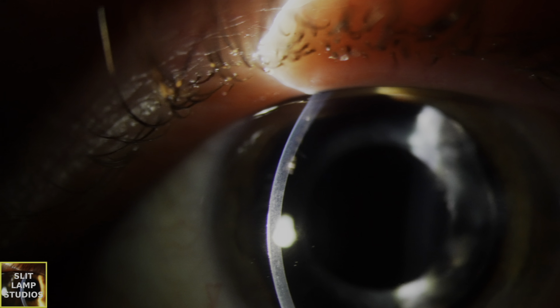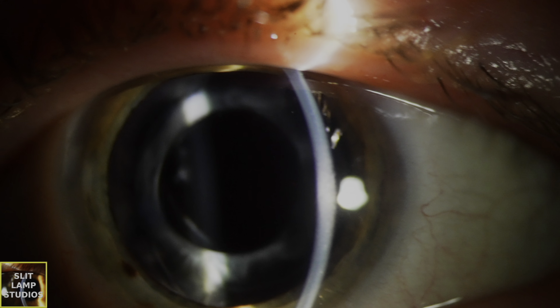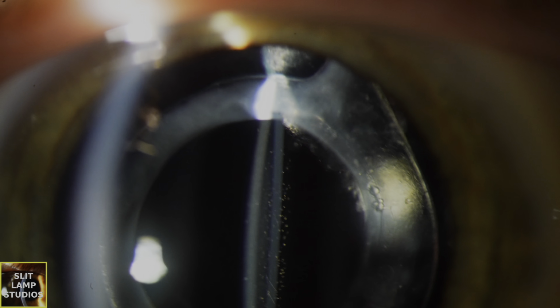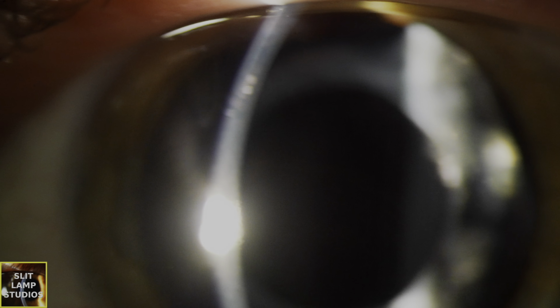So in this other eye, the patient's pseudophakic. They've had cataract surgery. You can see they've also had a YAG capsulotomy. And let's have a look at that vitreous to see what's going on there. People do often describe the vitreous of patients with Stickler's syndrome as being quite optically empty. But sometimes you can also describe maybe seeing some veils or some sheets of vitreous or persistent cortical vitreous as well.